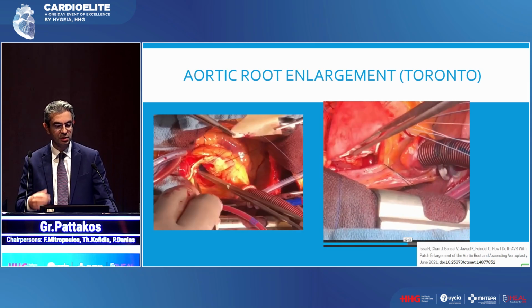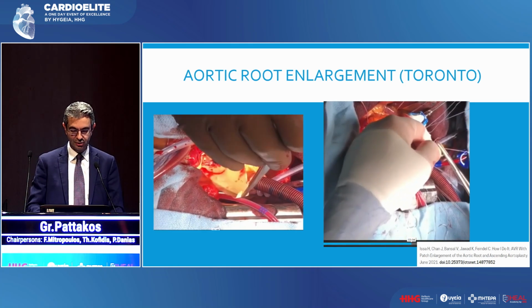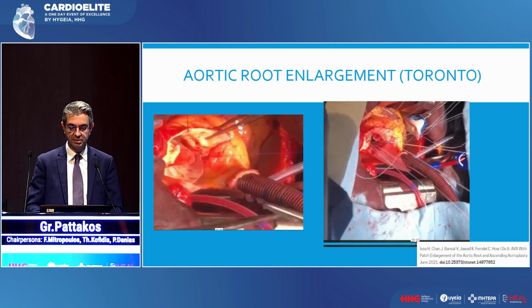So this is one of the nicer videos I found online. I'll show you our case, but we don't have as good a videographer as they do in Toronto, apparently. Dr. Davierwala is looking at this as well. So this is a very nice aortic root enlargement that they performed in Toronto. You can see how the aortic annulus is opened.